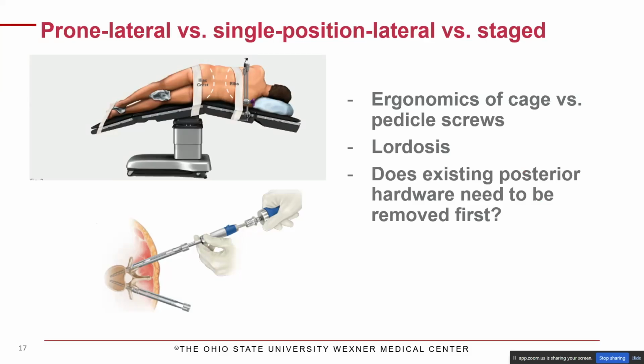And then finally, this is again a much more uncommon situation, but if the person has existing hardware that needs to be removed, I definitely feel that this position is suboptimal. Having to reopen and re-expose the posterior lumbar spine while somebody's lateral is not ideal.